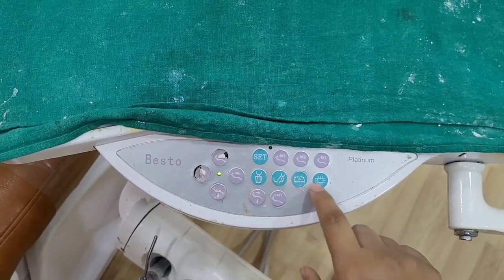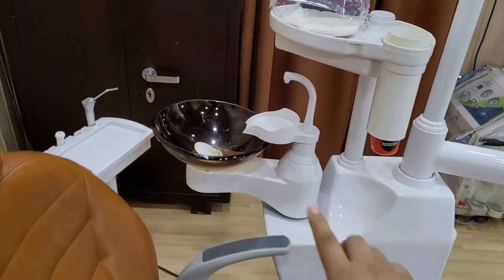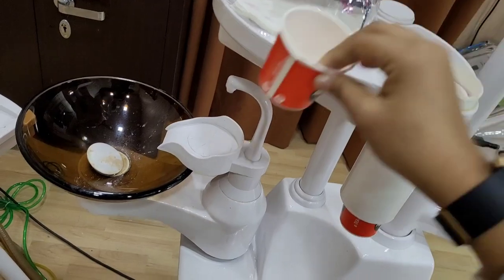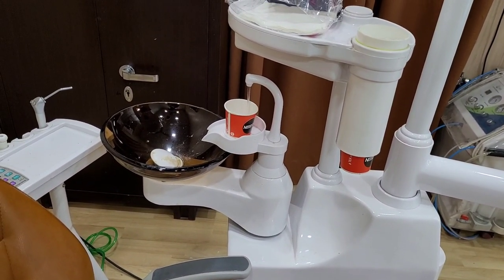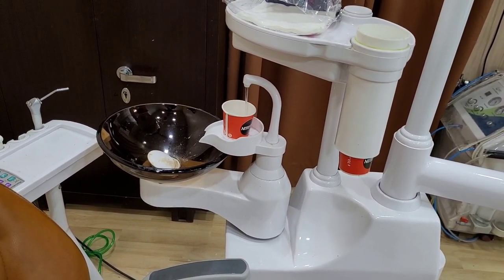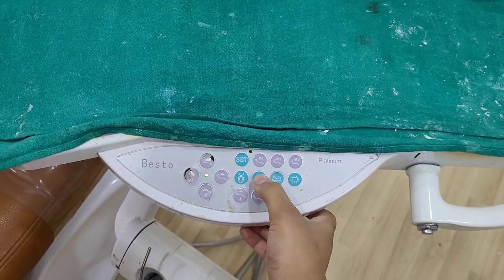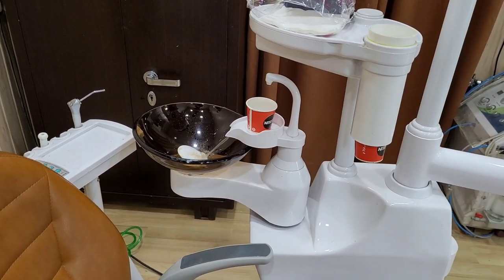Now we will talk about these four buttons. First of all, there is a button for the water glass — it will fill the glass with water for the patient. We press the button and water fills up. Then we press again to stop the water. This is the water glass button.